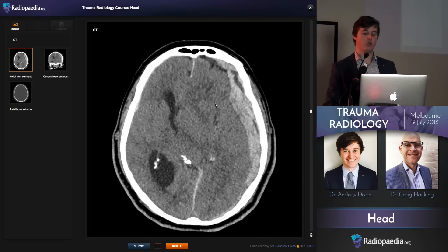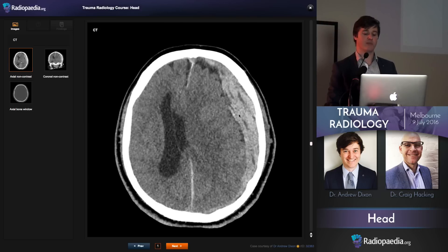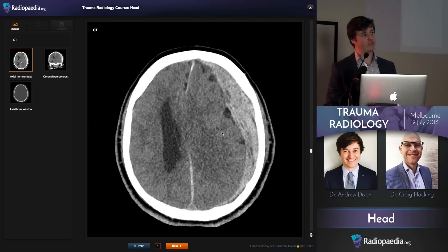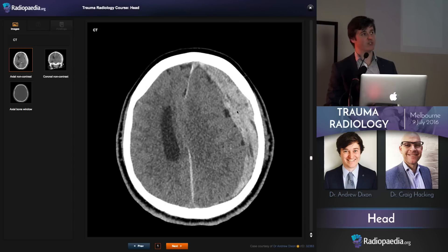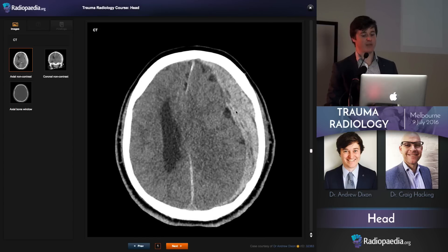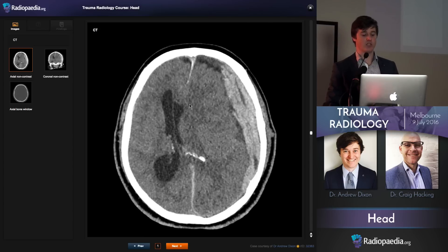There's a whole lot of blood there, a whole lot of mass effect. It doesn't look as dramatic as the extradural, so beware of subdural hematomas and underestimating their mass effect.